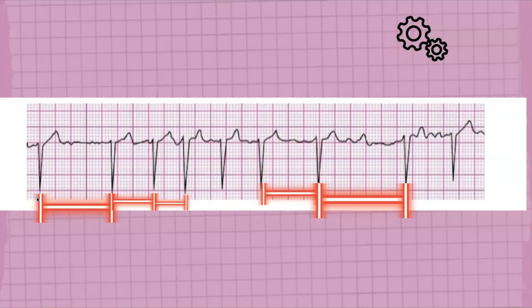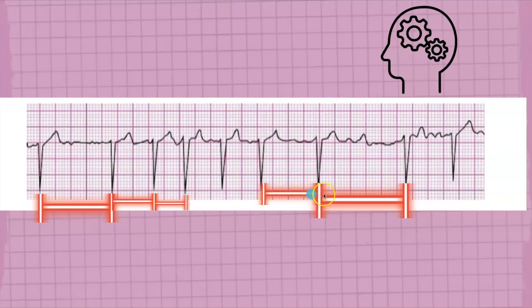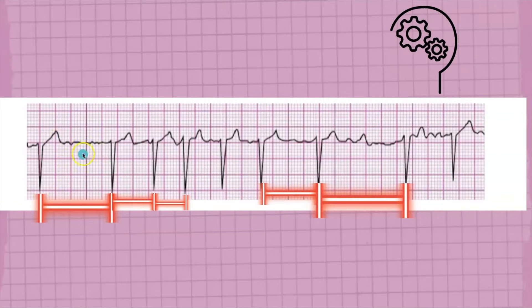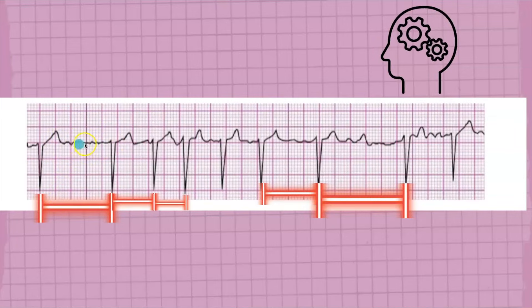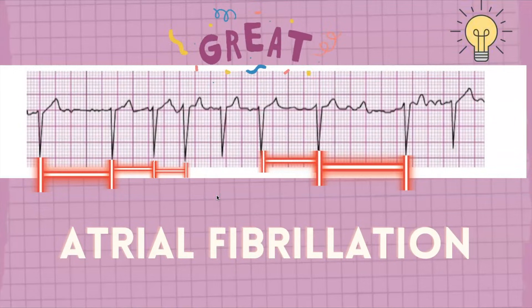Maybe you're thinking — is this SVT, supraventricular tachycardia? SVT is a regular rhythm. Look at your R-to-R interval: it's all over the place — this one is long, this is short, this is shorter, this is medium, this is longer. The R-to-R interval is irregular. Also, you don't really see clear P waves — they're not clearly discernible. If you said atrial fibrillation, you are correct.